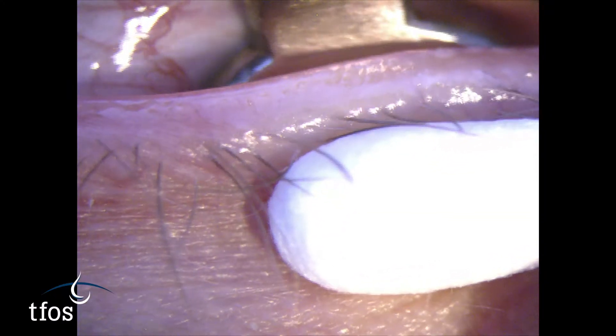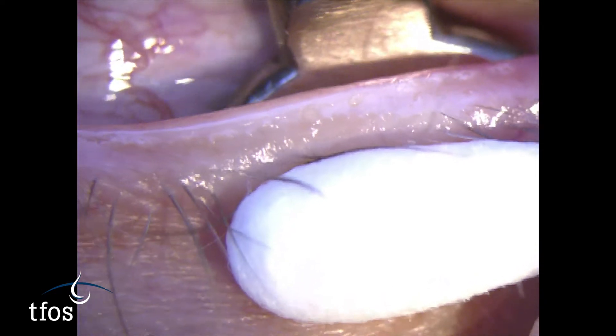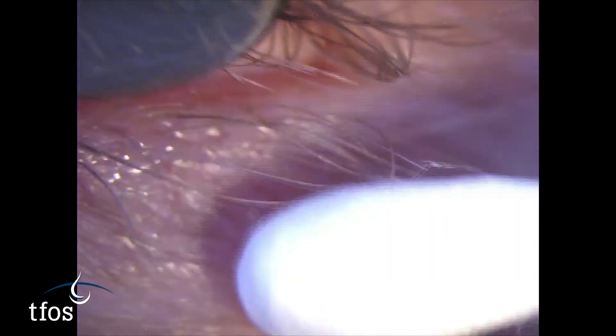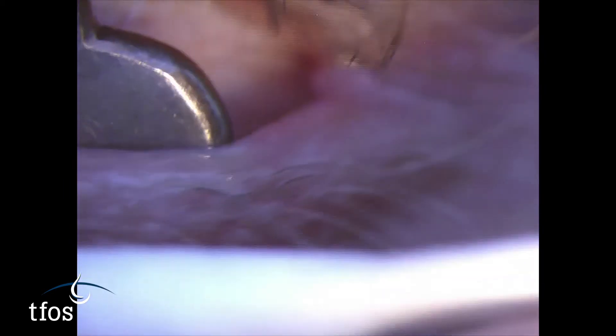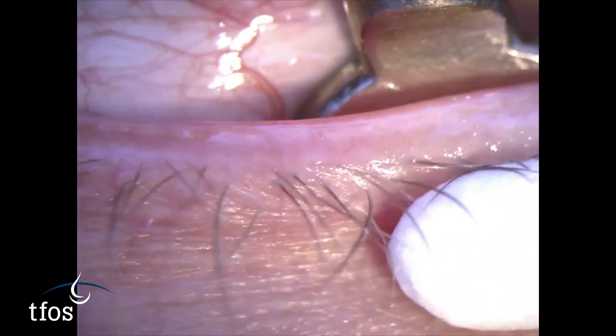With the paddle situated behind the lower lid, the cotton-tipped applicator should be rolled upwards to encourage expression of the gland contents. The paddle and cotton-tipped applicator are moved progressively along the lid to express each of the glands in turn.